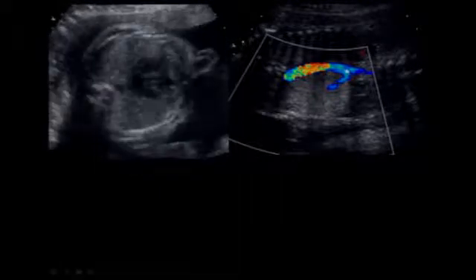So here's a patient with an echogenic mass on the left side in the lower lobe. And so the next thing we're going to do is look at the lesion sagittally, take an image of the descending aorta and look for the blood supply coming from the descending aorta. And the blood supply is very characteristic.